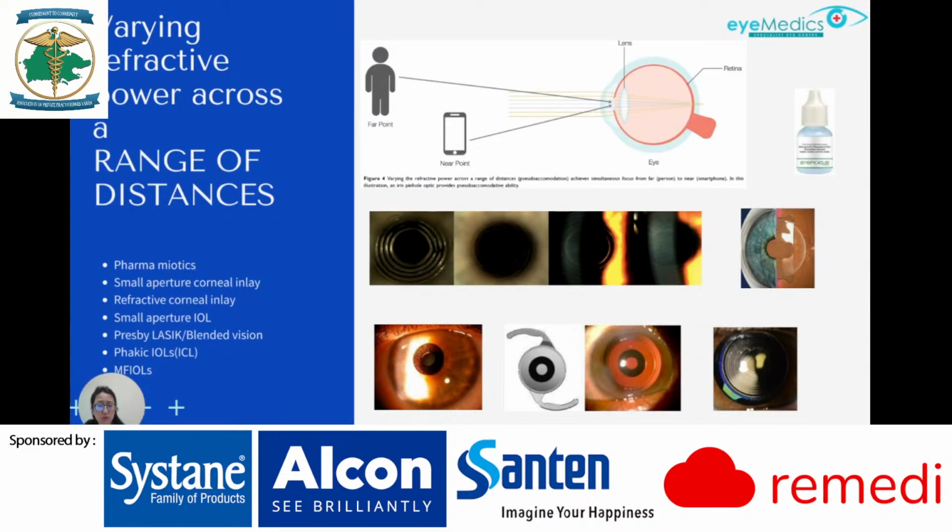The fourth method would be varying the refractive state of the eye across a range of distances. This refers to the creation of simultaneous focus through far, intermediate, and near. Examples of these are small aperture cornea inlays, small aperture intraocular lens, presbyopic LASIK, implantable contact lens, and also multifocal intraocular lens.